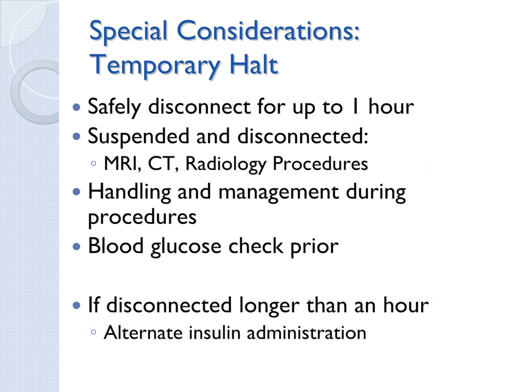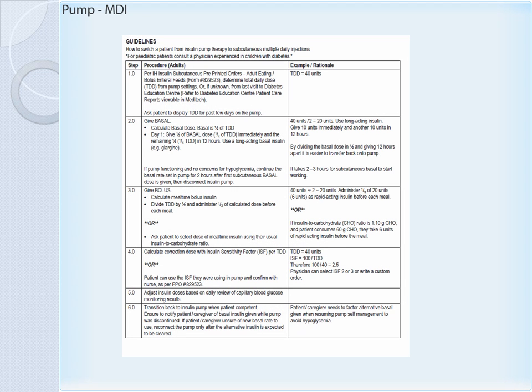Basal insulin takes about 2 hours to cover their basal needs, and pumps may need to be continued for a bit of time until the subcutaneous basal is effective. Once again, a decision support is available on the back of page 1 of the pre-printed orders that helps to inform physicians how to write orders transferring patients from the pump to subcutaneous insulin.